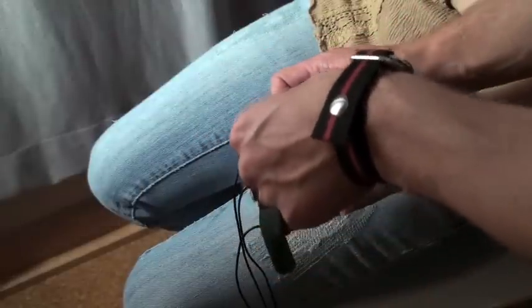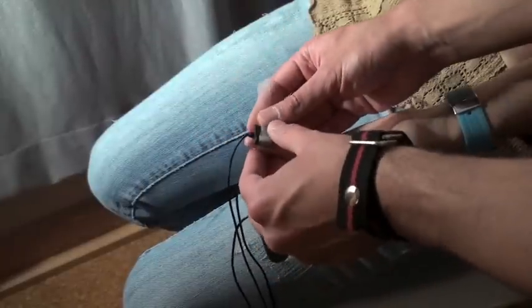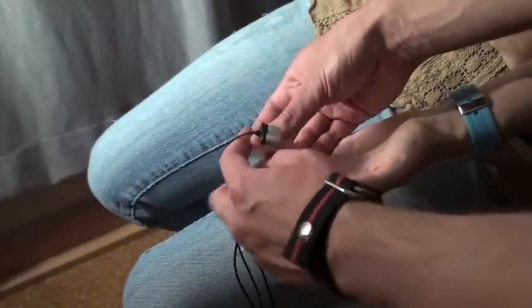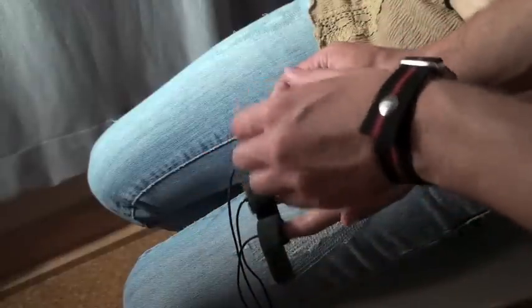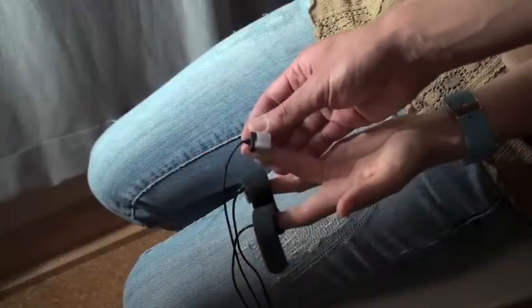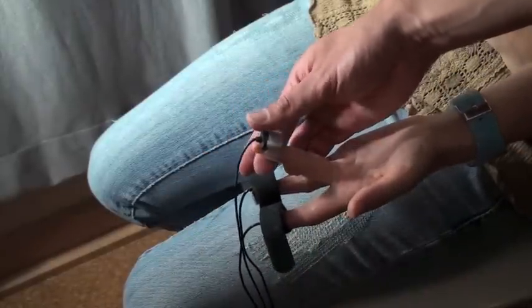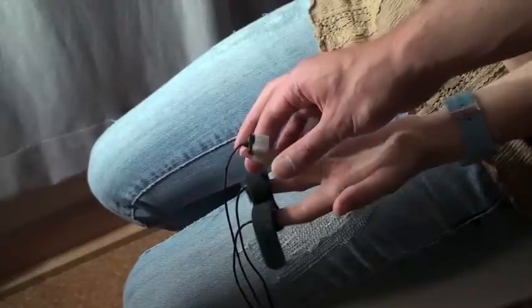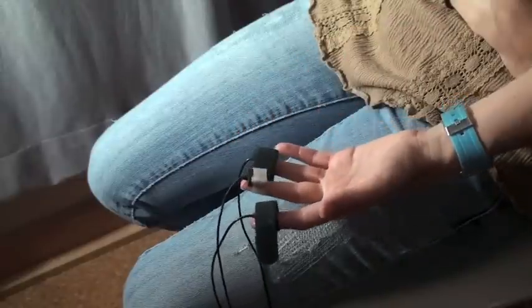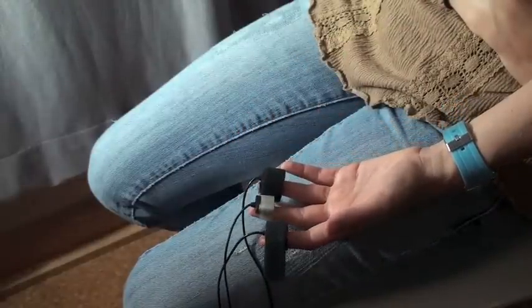Tell the participant to place their hand in a comfortable position and leave it that way for the experiment. They should not move their hand while HRV recordings are taken. The signal should move up and down at a steady pace. If it isn't, you can adjust LP from 3 to 10 and see if it fixes the signal.